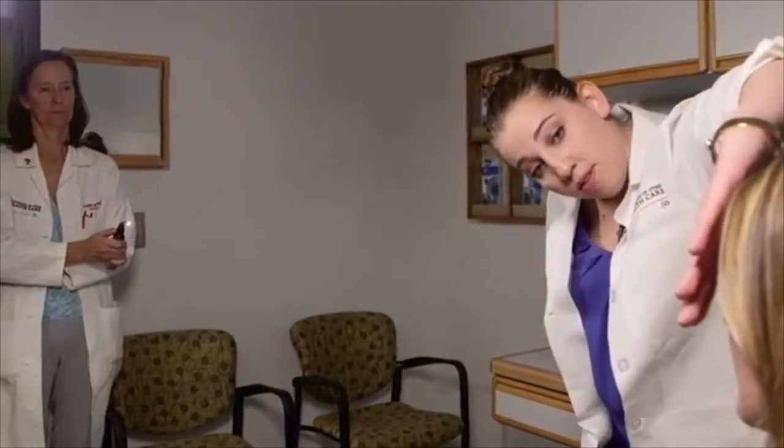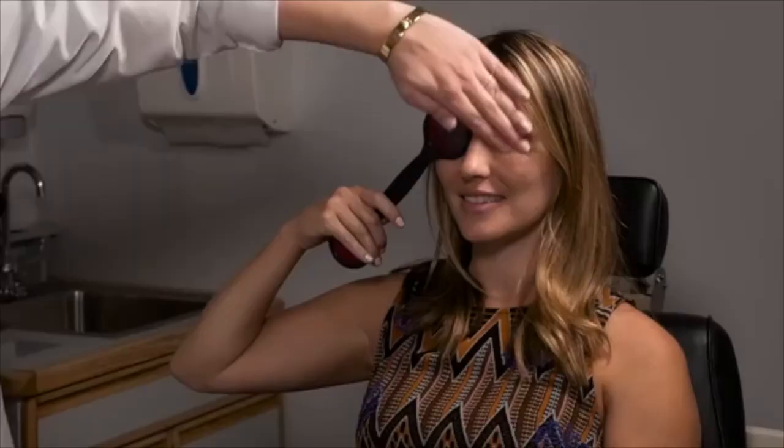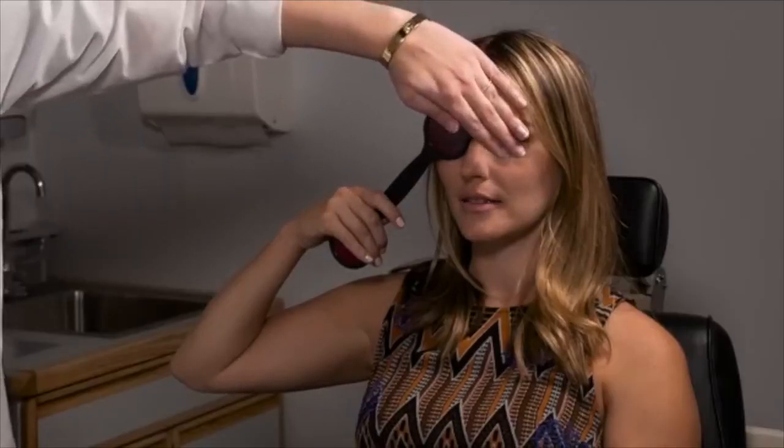And you have your assistant hold a muscle light down at the end of the room. So can you appreciate that there's a horizontal red line when you're looking through your right eye? Yes. And you can kind of rotate that to make it perfectly parallel with the floor. Okay, so when you're looking down at that red light, or the white light, sorry, is the white light above or below the red line? Or right on? Right on it. So she's very well aligned. So the light and the line are at the same level.